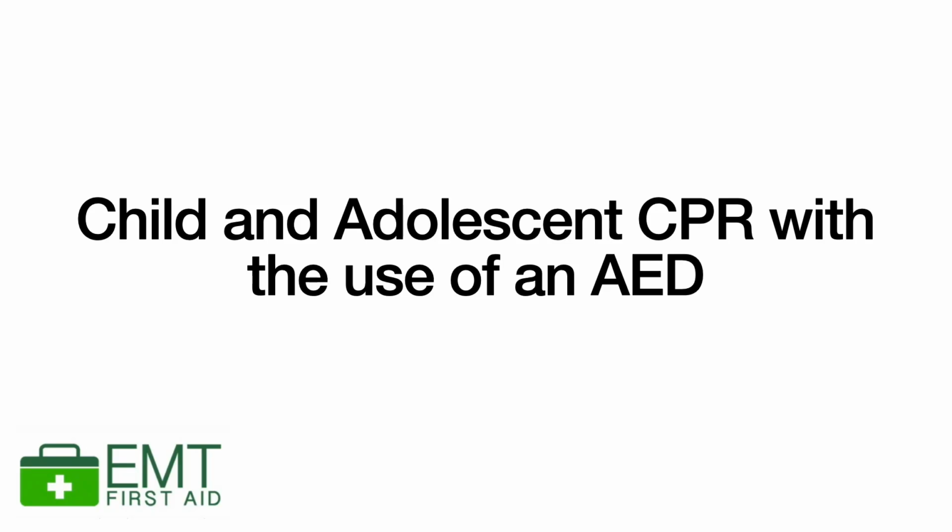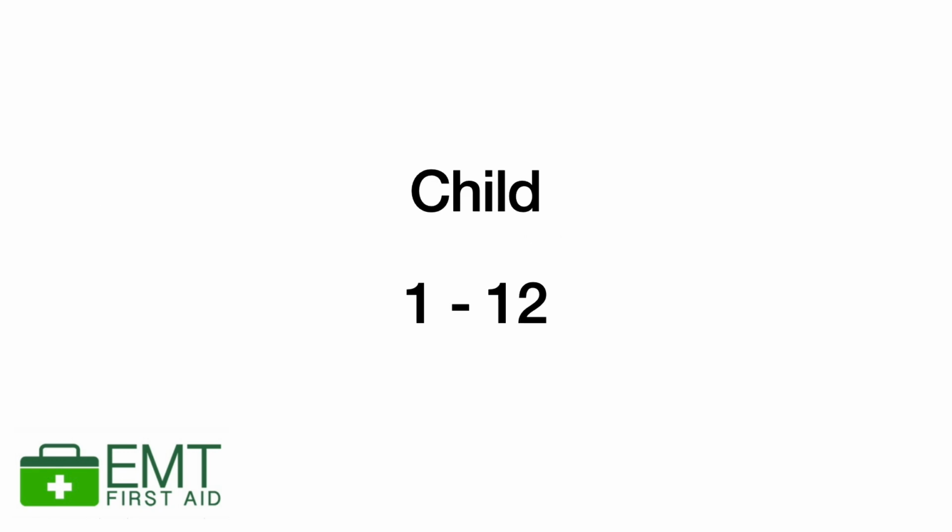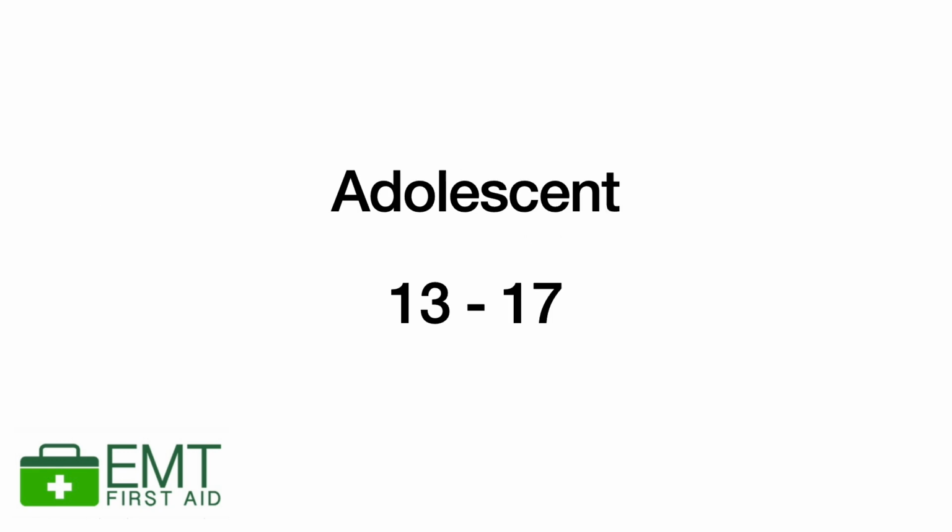So in this video, we're going to look at child and adolescent CPR with the use of an AED. Just to recap, a child is 1 to 12 and an adolescent is age 13 to 17.